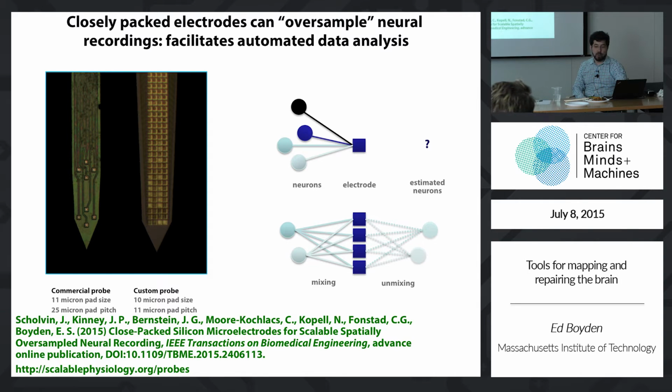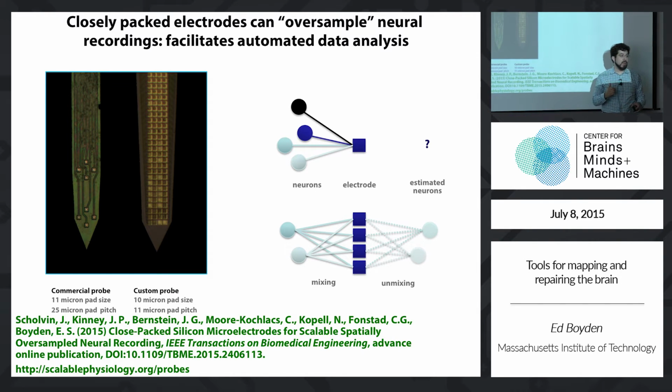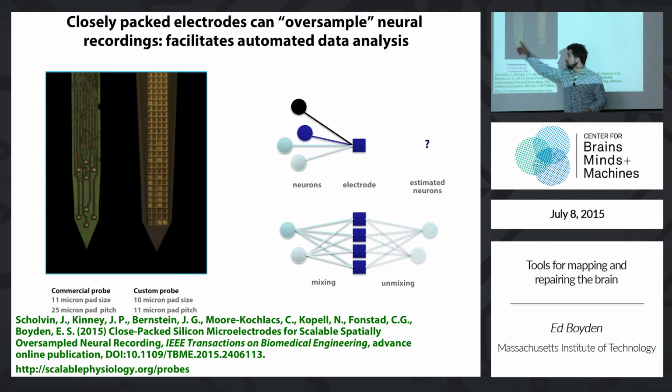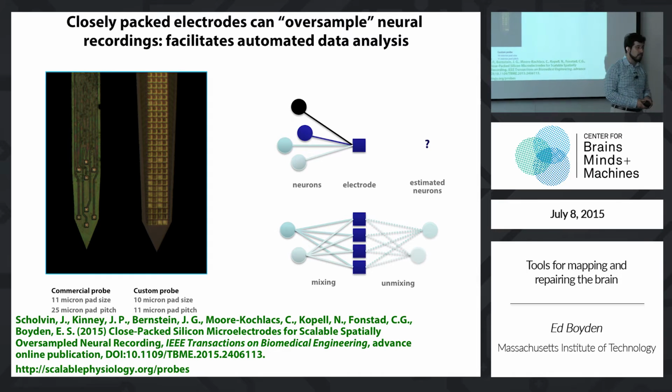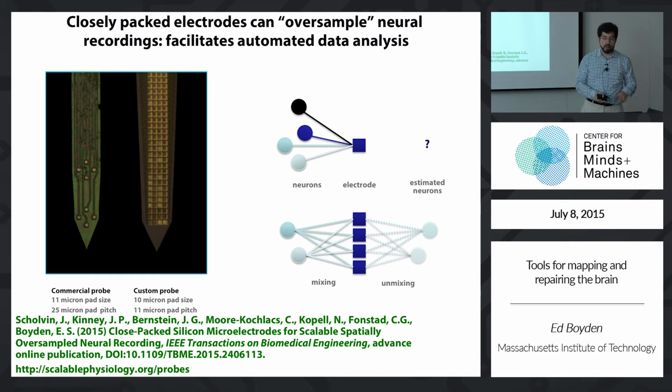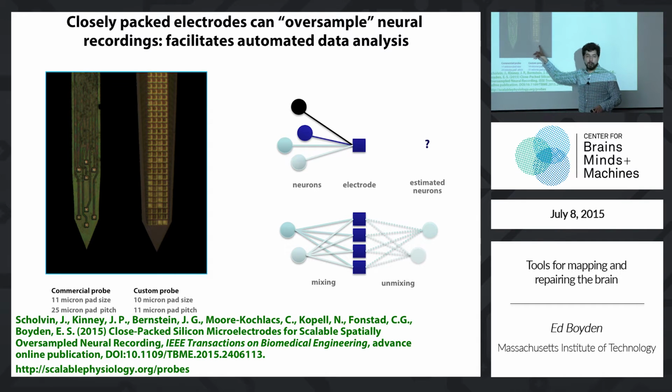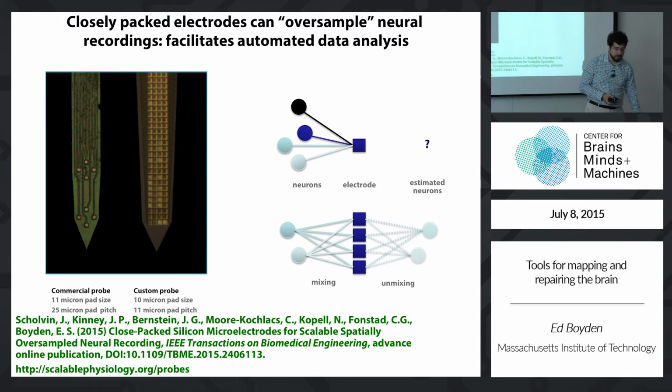We've also been working on electrodes, and in particular, on electrodes that have very densely packed electrodes. So here's a traditional electrode array made out of silicon with gold pads. And you can see 4 gold pads here and 4 there. Here's what we're making. We're making electrode arrays that are needle-like that you can put into the brain that have hundreds or thousands of electrodes. So a vast increase in the number of possible electrodes. Now, how do we do it? It's because we're doing nanolithography, basically using electron beams to indicate the paths to make the metal traces on.